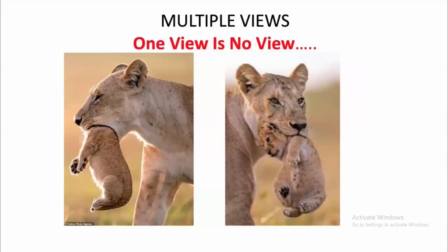You cannot put your probe on the parasternal long axis and say this is poor contractility. You have to assess apical, parasternal long axis, parasternal short axis, apical 4, and subcostal view to say this is poor contractility. So just remember this one because this is very, very important. I will say it is a part of clinical judgment. It is not the end of clinical judgment.